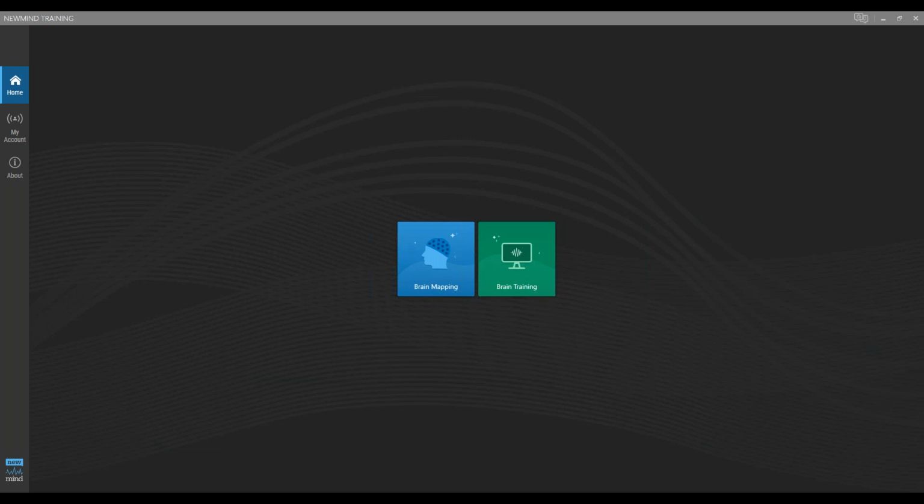So photic, the cable for those glasses is not a super heavy shielded cable, just because they have to be light and flexible. So we have to be mindful of the cable to the photic glasses comparatively to where our sensors are. Because of course our sensor wires also need to be light and flexible. So we can't put heavy shielding in those. It's just not possible. They'd be too stiff. It adds so much more weight. Trying to keep the sensors on would be difficult.